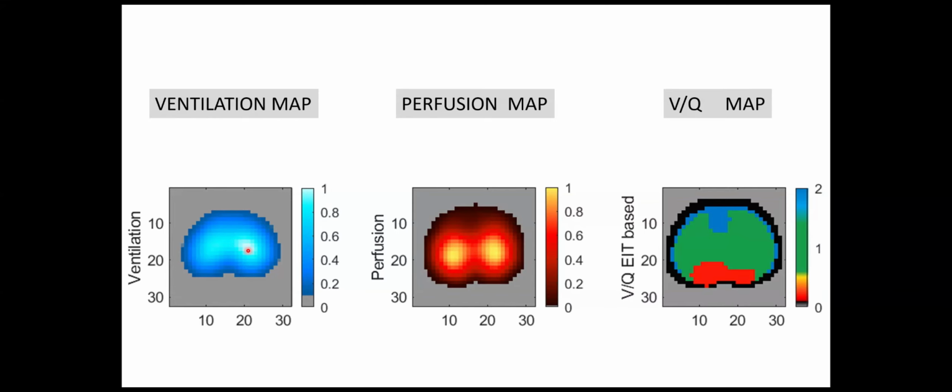Let's see how good we are at detecting pulmonary emboli, and how we are going to define pulmonary emboli. We have the Swan-Ganz, and we know when we have a complete occlusion of that vessel, because we have the wedge traces in the Swan-Ganz. And at the same time, we had the angiography, and then we had a radiologist measuring the clot burden.